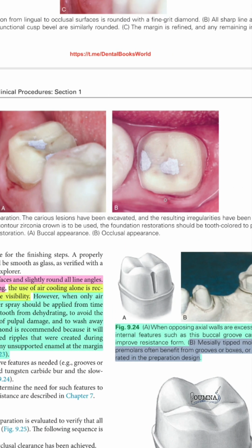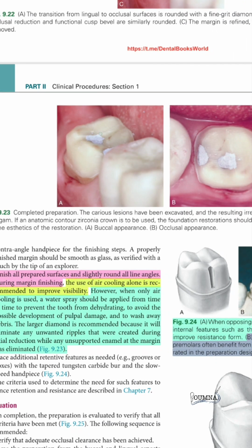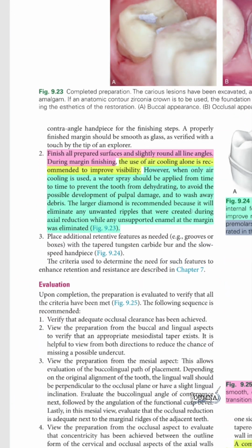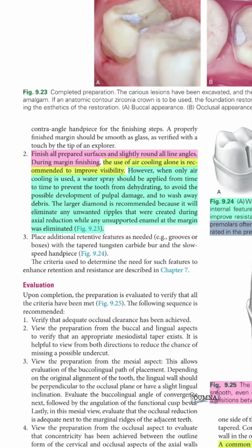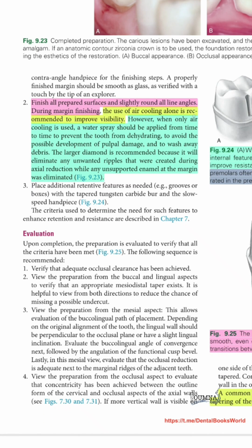We see that we have rounded angles throughout the teeth, and this is the lateral view. The final step is the finishing of all the prepared surfaces to get slightly rounded line angles.